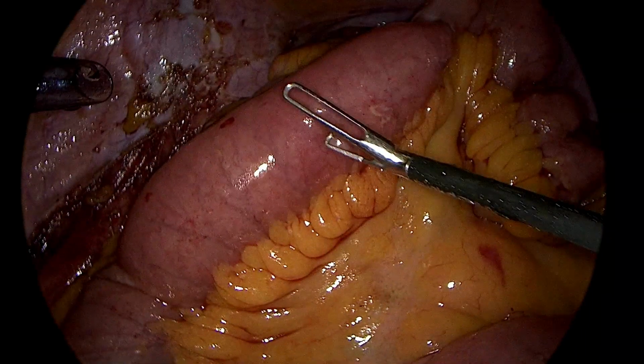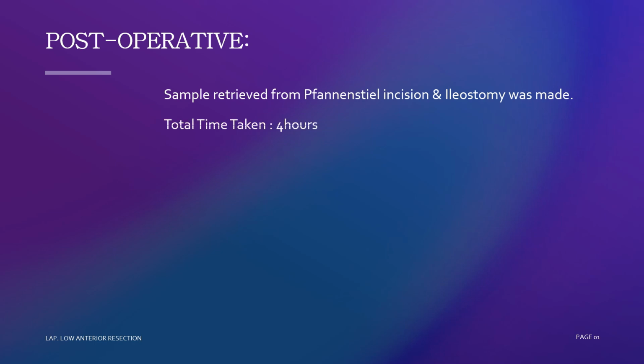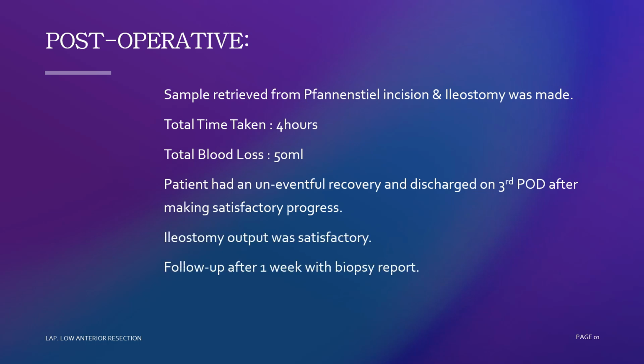Retrieval of sample from Pfannenstiel incision was done. Total time for surgery is 4 hours and total blood loss is 50 milliliters. Patient had an uneventful recovery and discharged on 3rd post-operative day. Patient progress is satisfactory and currently he is doing fine and taking orally.